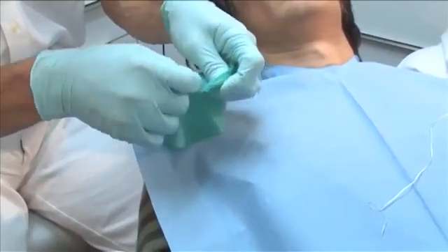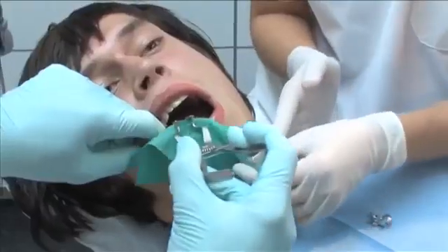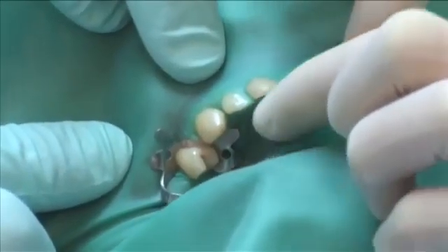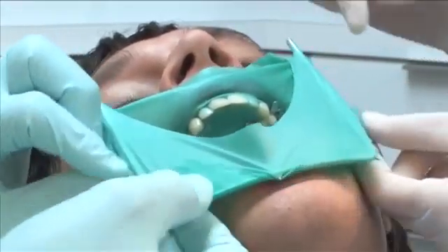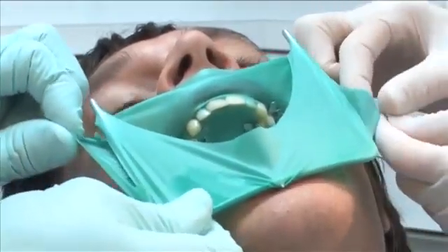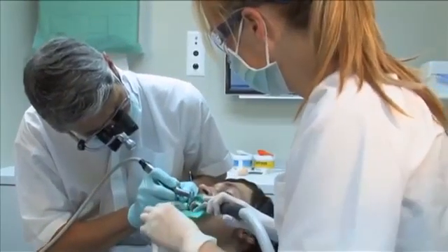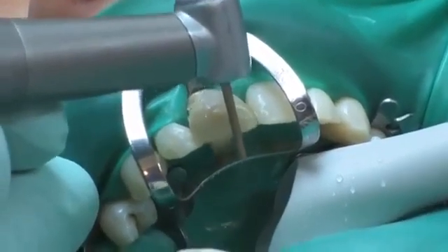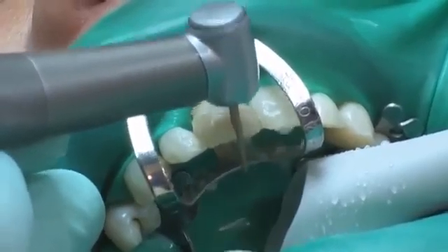A latex rubber dam is applied over the adjacent teeth to maintain a dry working field. The old non-aesthetic restoration is removed completely using a 125 micrometer diamond instrument until the pulp chamber is exposed.